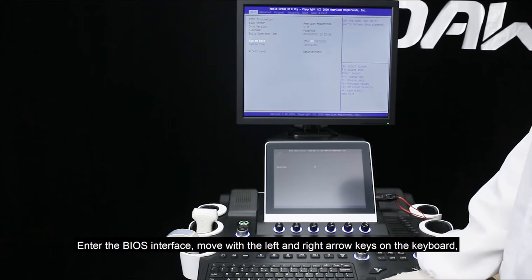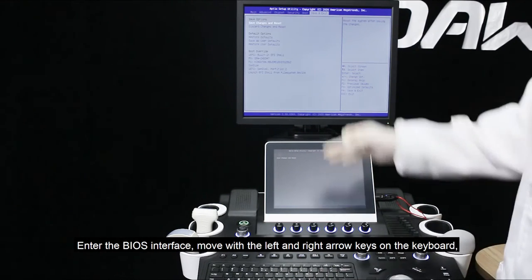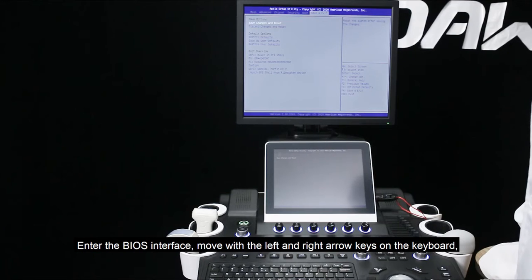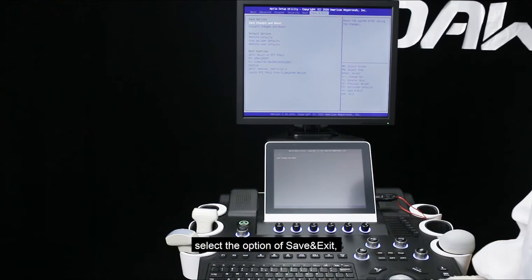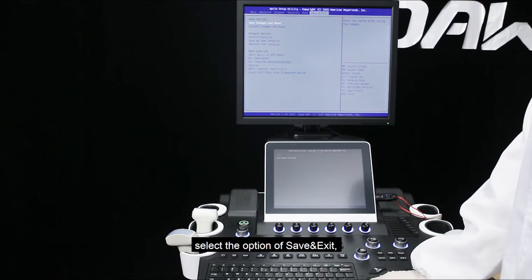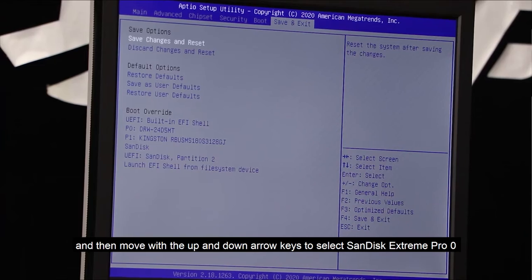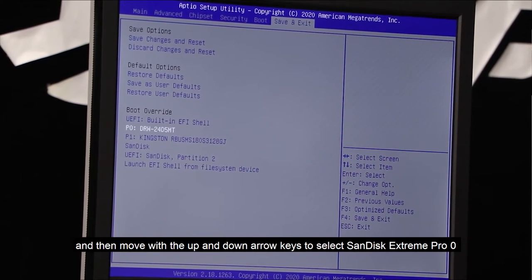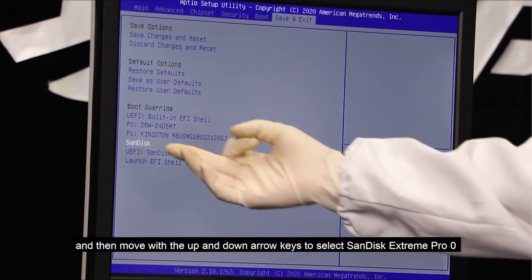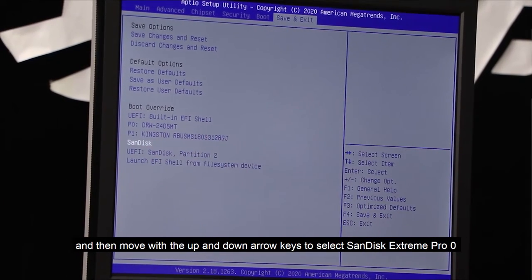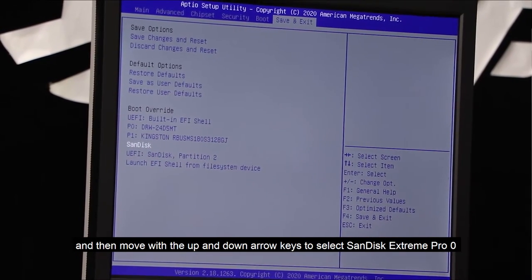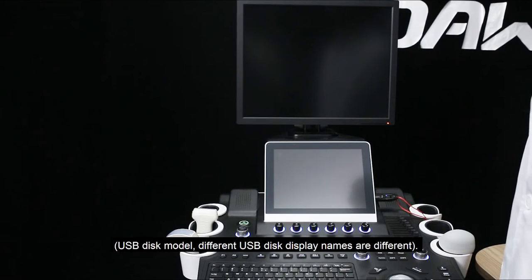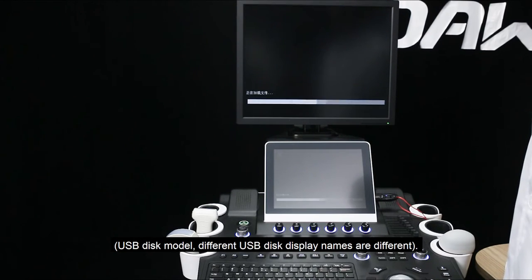Enter the BIOS interface, move with the left and right arrow keys on the keyboard, select the option of save and exit, and then move with the up and down arrow keys to select Sandisk Extreme Pro, the USB disk model. Different USB disk display names are different.